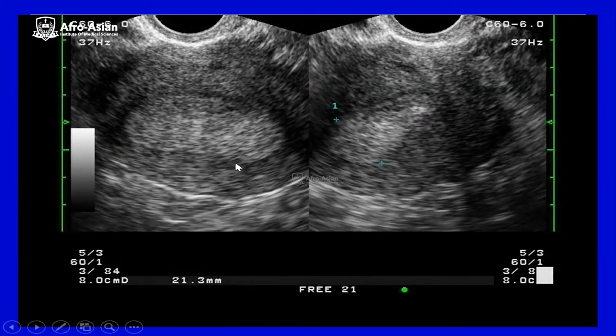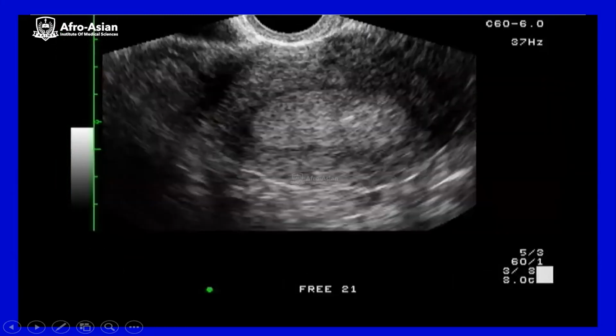And usually it is like a swollen endometrium. We don't usually see the line of the endometrial canal. So this is another cause of female infertility. Here it is. We can see the interface. Here is the other side. No endometrial canal visible. And it's hyperplasia, it is hyperechoic. Sometimes we can get the wall, but as it is swollen, so it will be compressed.